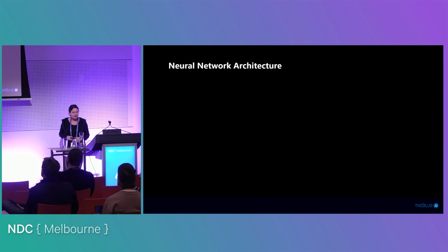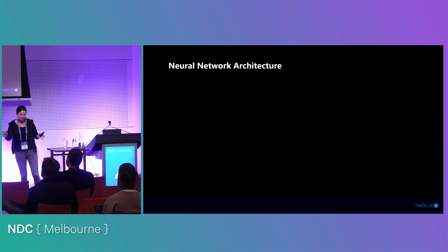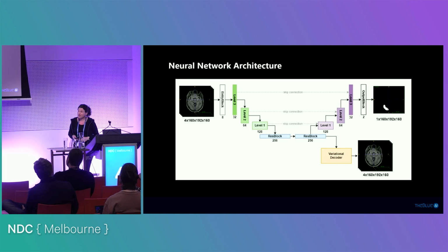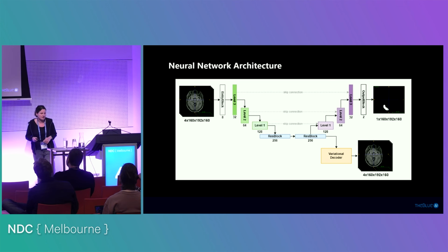So this is the part where we could go to our neural network architecture. We really checked a lot of them. We also tried the transfer learning approach, meaning that since we were already doing a lot of segmentation, we decided to take this and slightly adapt it. Well, that didn't work, so we needed to start from scratch. And this is a short version of our architecture. Each of these blocks again has different layers. If you're interested, I will also reference it at the end.